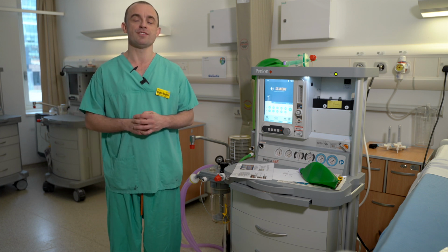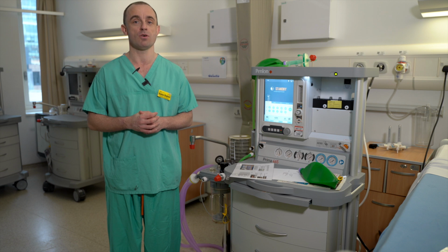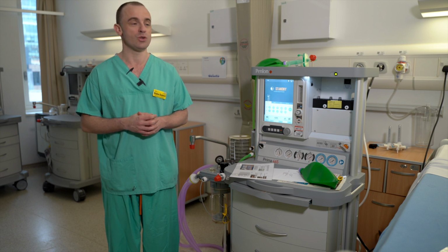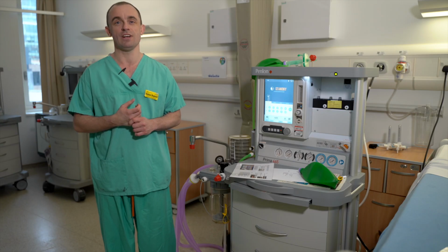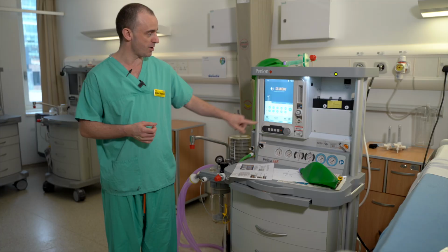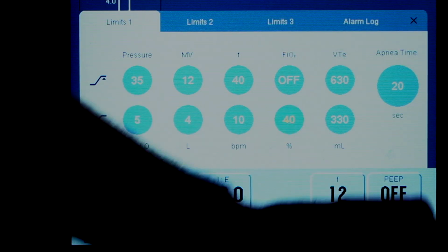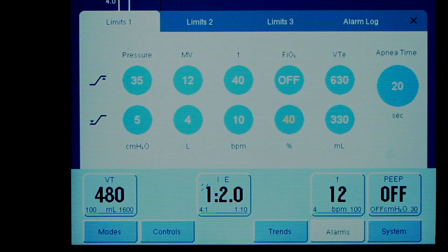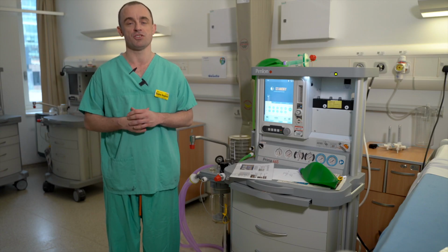The other concern with that is because you're using a blended system of gases, it's possible to give a blend that may give you a hypoxic mixture. And so you can see here the low FiO2 alarm defaults to 20%. Again, that's not really suitable for the majority of our patients, and we're going to recommend a baseline of 40 as a standard. This can be adjusted as patients improve, but will cover a safe margin in the majority of patients.